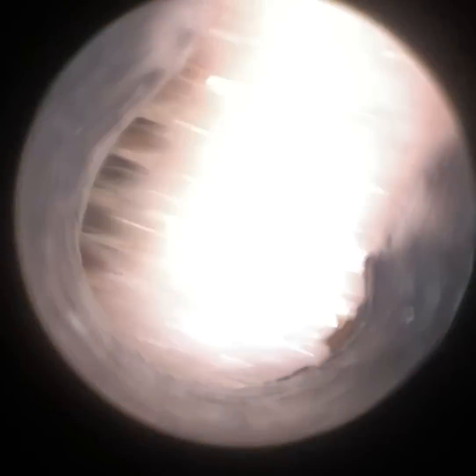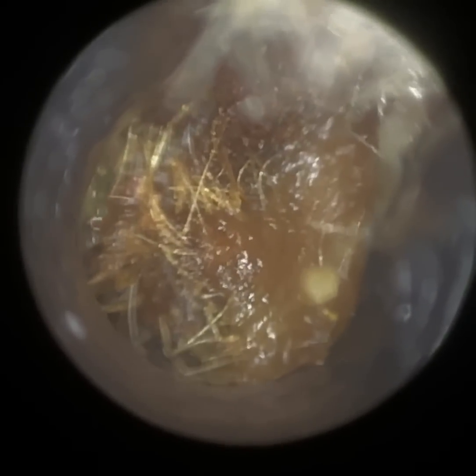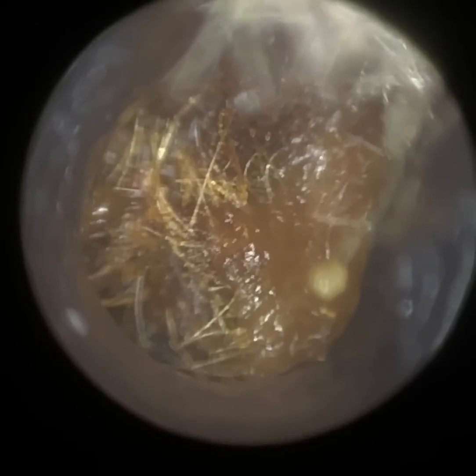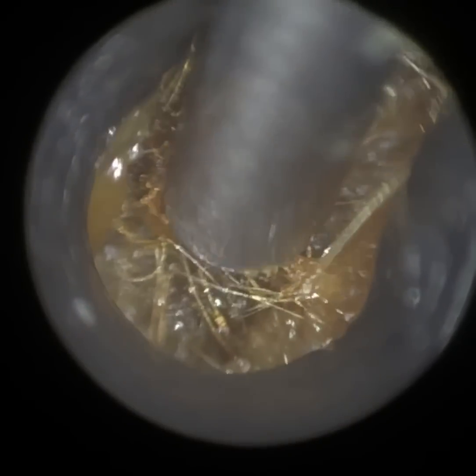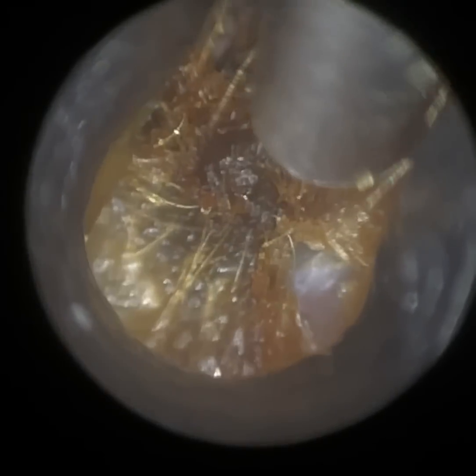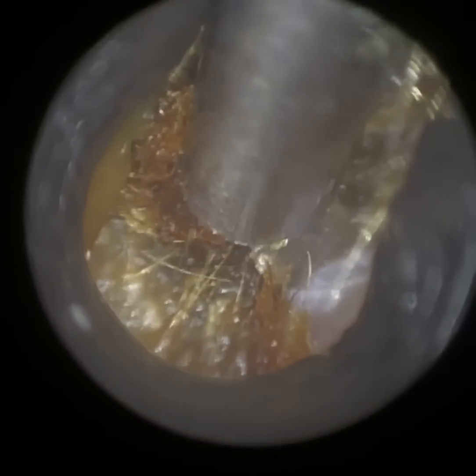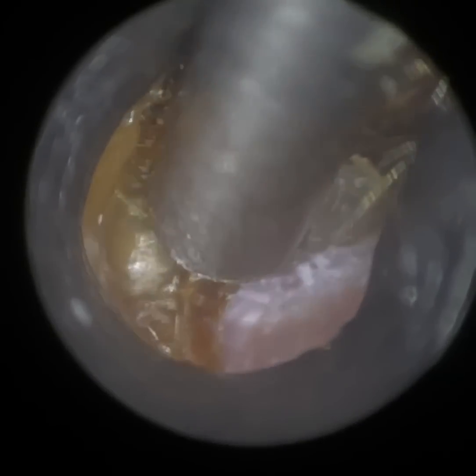I've just put a fresh dose of some olive oil spray, which has changed the consistency. You can see all those hairs there — they are matted — and the patient had been using cotton buds. Whenever you've got matted earwax, it is a bit more tricky to remove because it's harder to get a suction grip. I'm just working around the edge, trying to loosen this adhered wax and keratin off the canal wall.